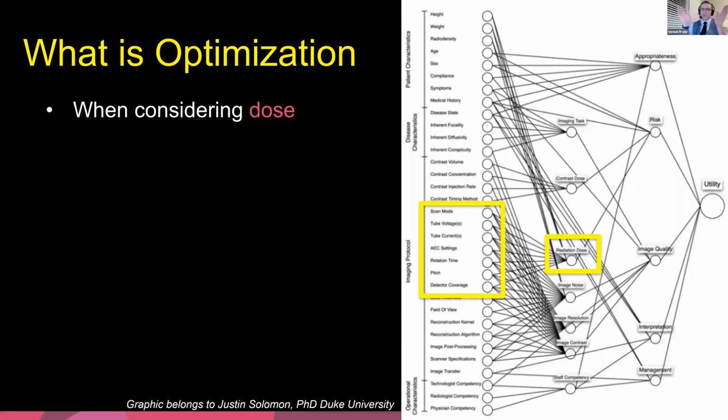Do we look at organ dose modulation? Are we setting the right appropriateness criteria, clinical indication? I mean, there are just all of these things we have to take into account. And it's really good to have a team look at that so no one step is missed, instead of just having the technologist do it, or the radiologist or physicist do it alone.